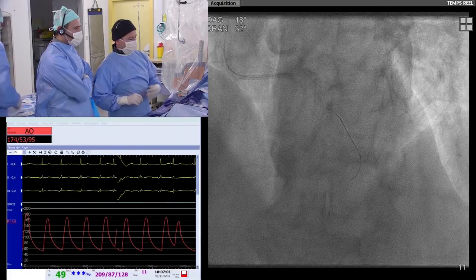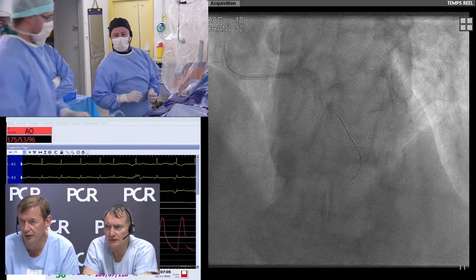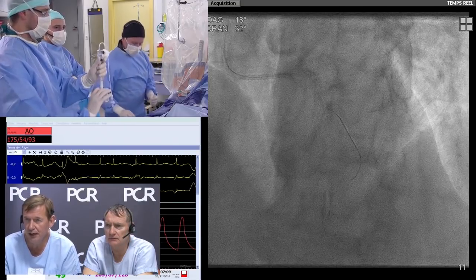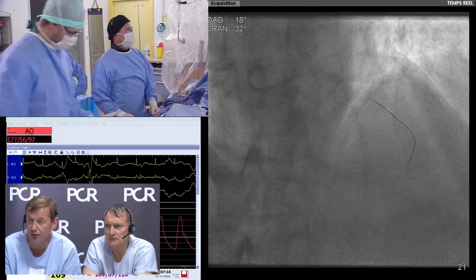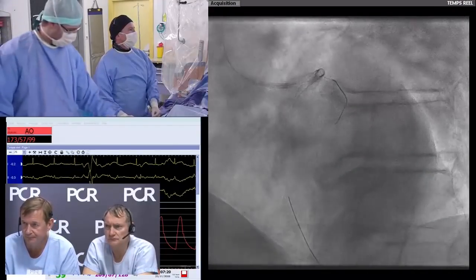Are you okay? Yeah, it's a common myth. A common myth that people think that calcification protects you from perforation. But you need to be very careful and make sure you do get your sizes correct, as balloon perforation post-rotor and stenting can still happen. Right.